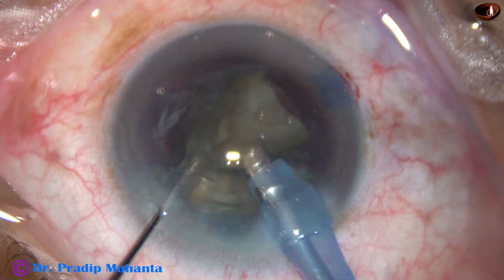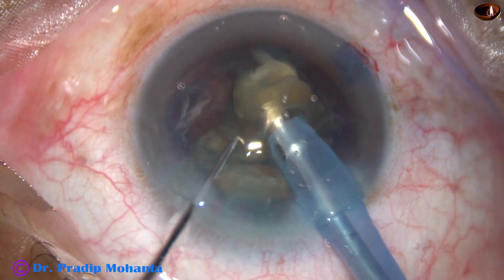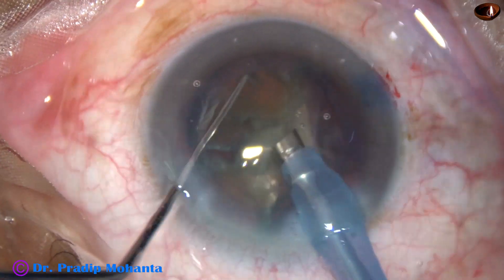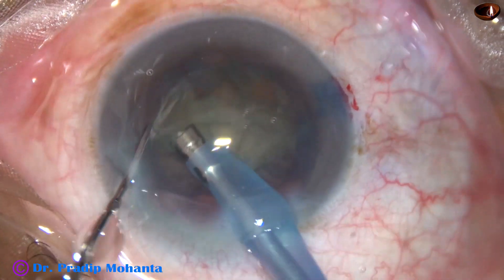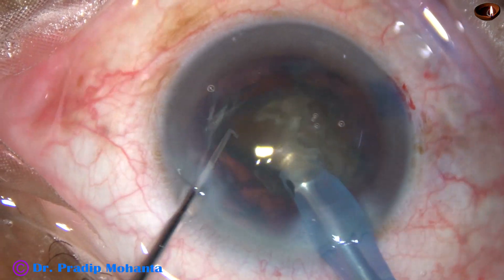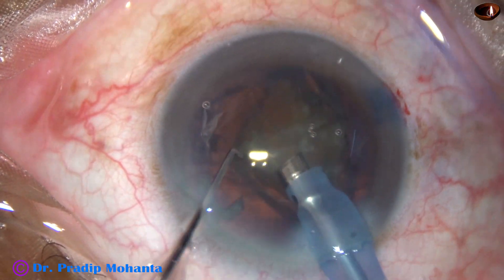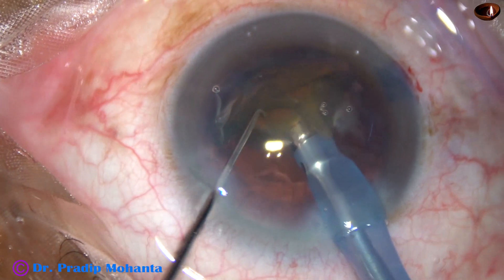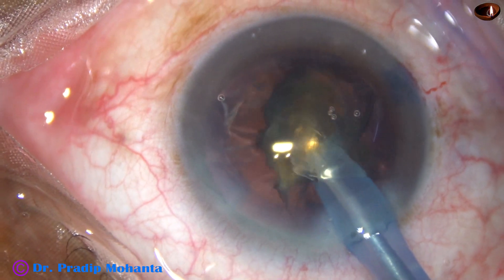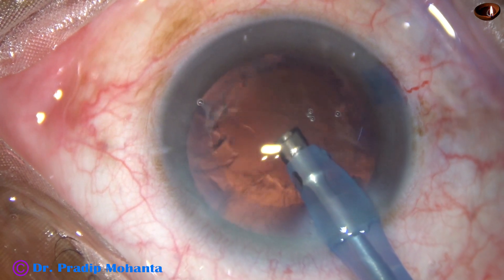Ultrasonic energy used in this case from the very beginning is 70%. Flow rate is 40 and vacuum is 400 mmHg. This is the Oertli Catarex Easy vacuum machine — a basic machine from Oertli of Switzerland, but very good for all kinds of cataracts. The design of the phaco needle is such that there is enough fluid all around and wound burn never occurs even with ultrasound applied in continuous mode.